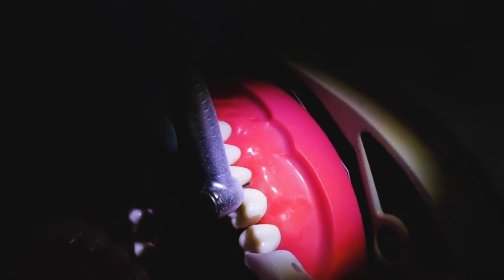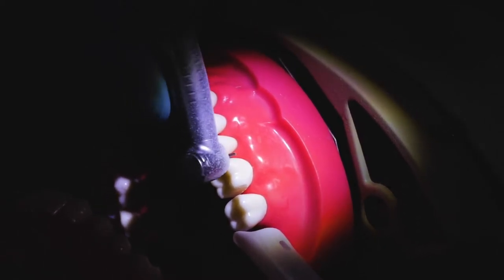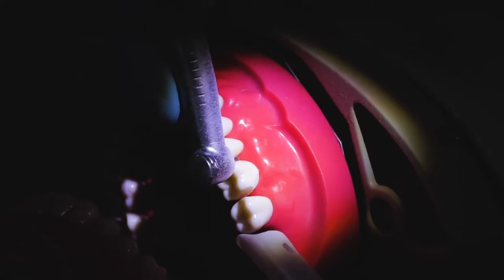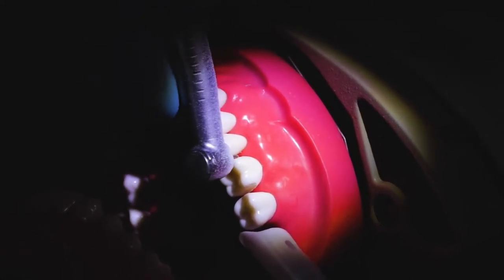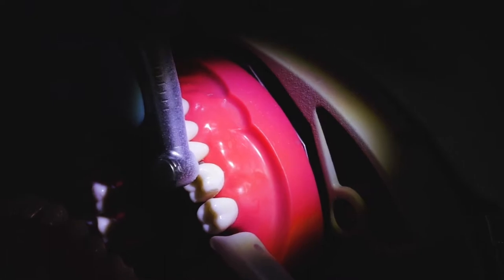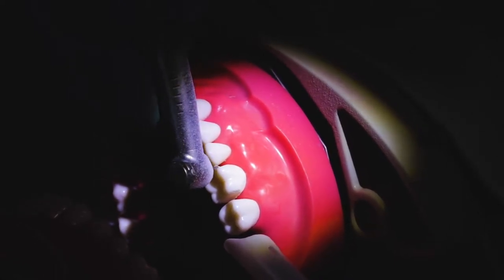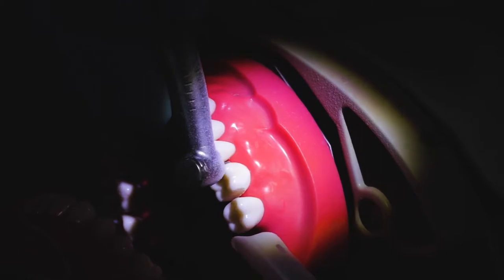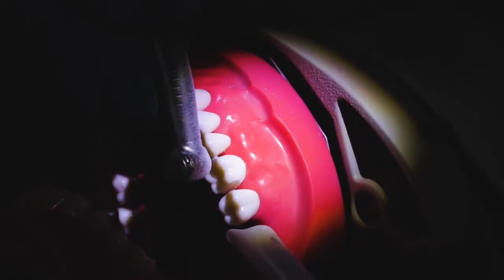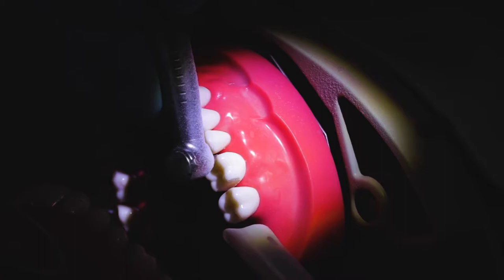We'll move to the mesial now and tip the other way. The shape of the proximal surfaces on both tooth number 13, the premolar, and number 15, the molar, will dictate the angulation of this burr cut and it will be a little bit over-tapered — we can't help that. Again, keep a little distance between you and the adjacent tooth and just light brush strokes as you go; don't let it throw you into that adjacent tooth. And we have contacts broken and we're now ready to place guide cuts.